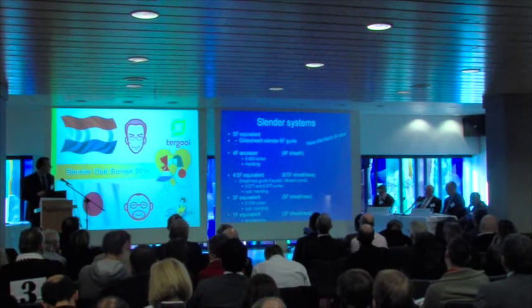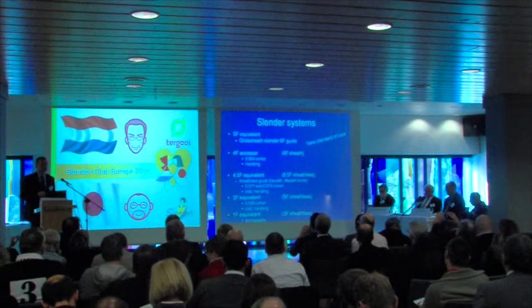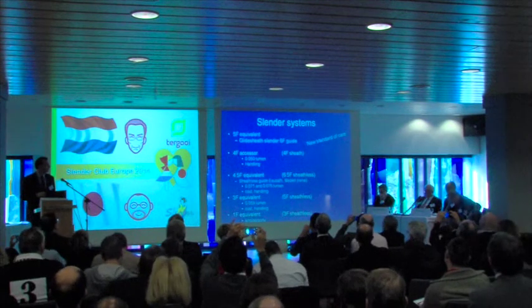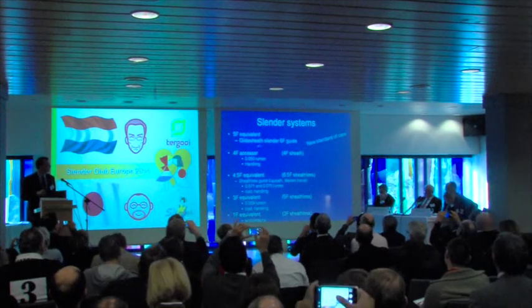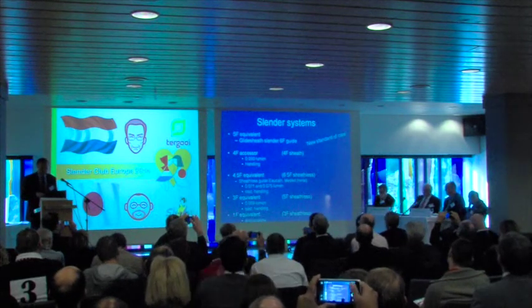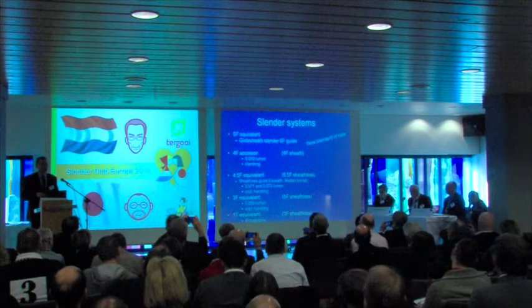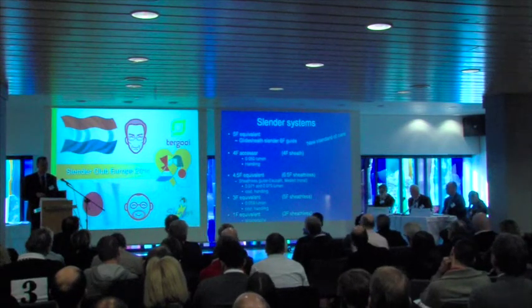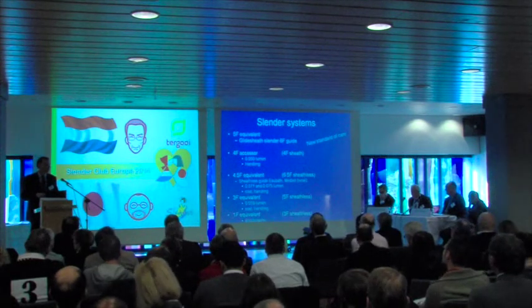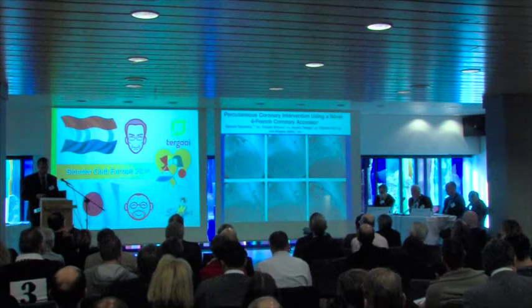So where are we now? I think the Glidesheath Slender is an excellent solution to 6 French. It reduces our sheath size to essentially 5 French. And then if we want to go smaller than that, we'll see a lot of these other techniques over the next few days. But I would say that there are difficulties with these techniques, and that what we really need is industry and individuals to be very interested and involved in this issue, to progress the field further.